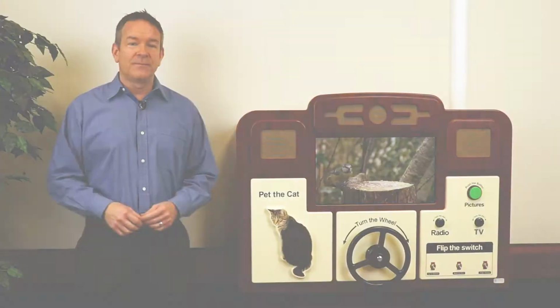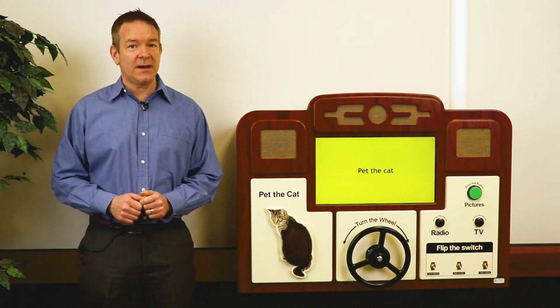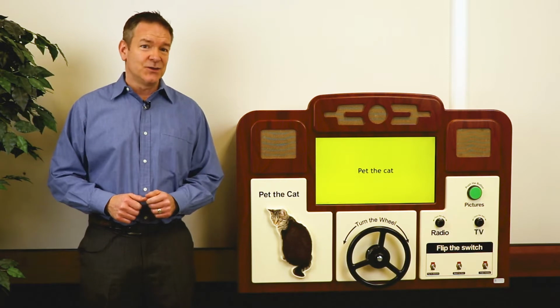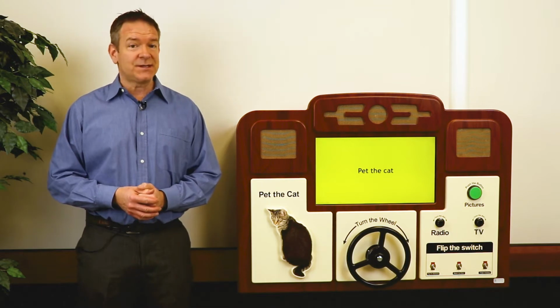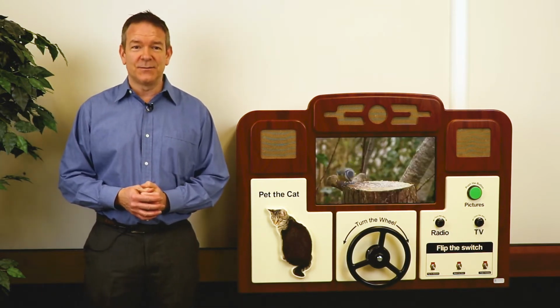As a quick disclaimer before starting, we're constantly upgrading and implementing sensitive and meaningful changes to our systems, so your unit may not exactly resemble what's shown here in this video. But the disassembly shown in this video is the same throughout all of our ABBY systems.